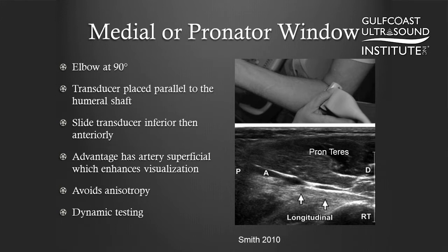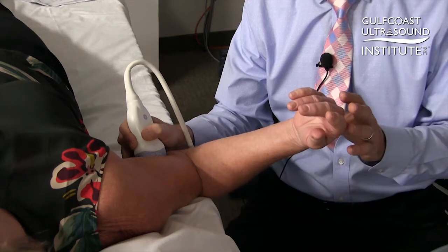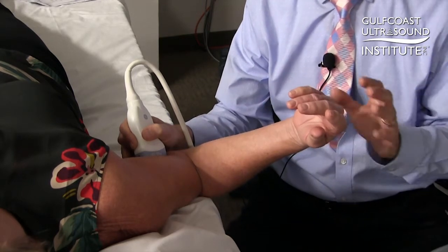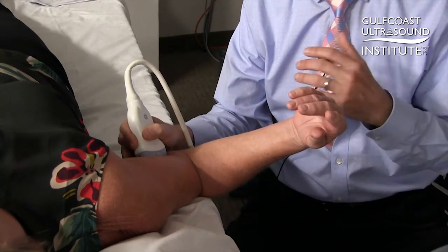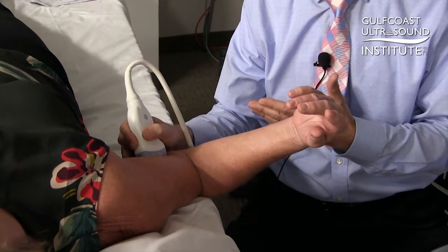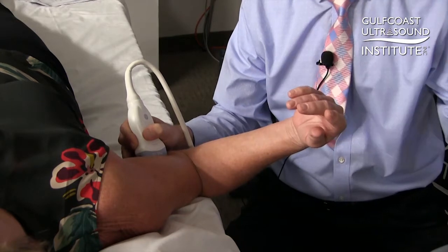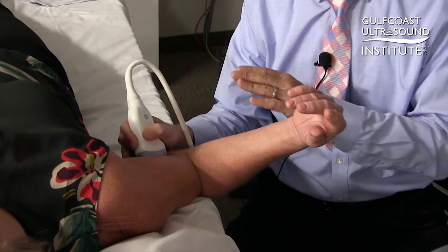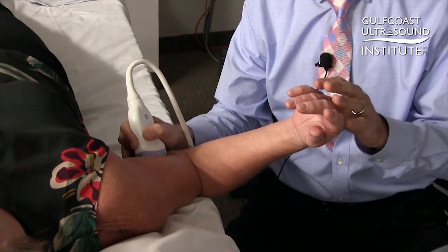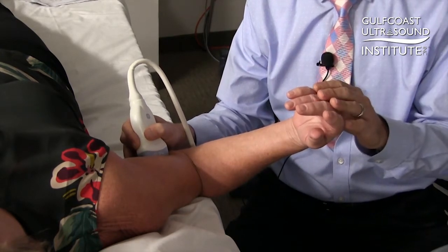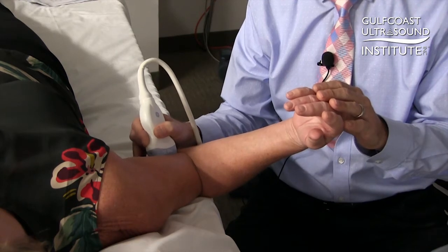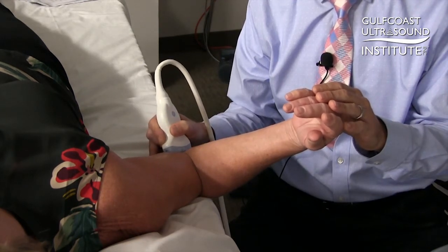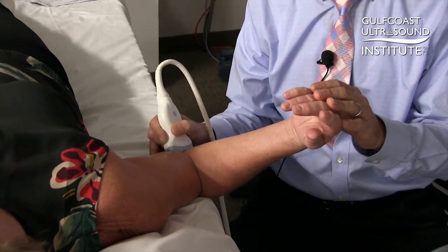One of the key things to start out with is the transducer laying parallel on the medial humerus. I often tell people starting out: don't bother looking at the screen when you're first starting out, just look at the transducer and the arm. What you're going to do is slide the transducer down distally until it reaches the antecubital fossa, or just distal to that.